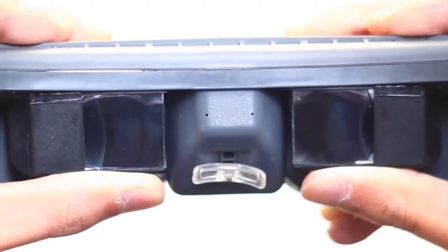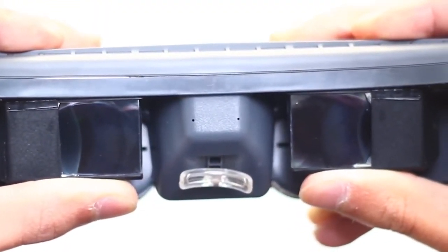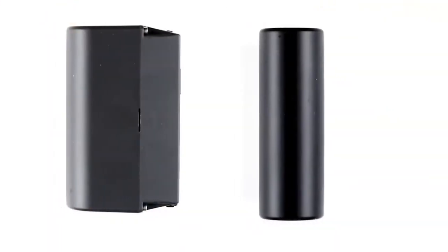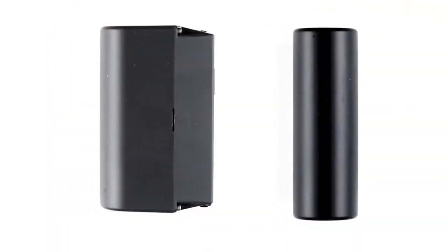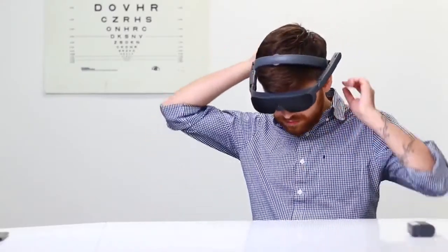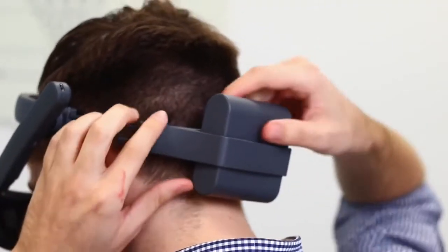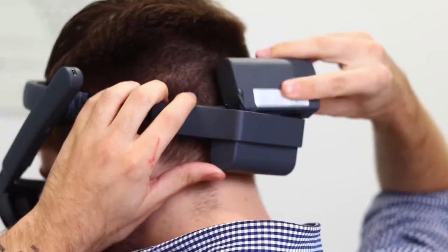Likewise, adjusting the pupillary distance allows for the optimal field of view for the wearer. eSight 4 comes with two rechargeable batteries, each with up to three hours of continuous use. Shake the battery — a red light indicates it is time to charge. The battery can be inserted in either direction.